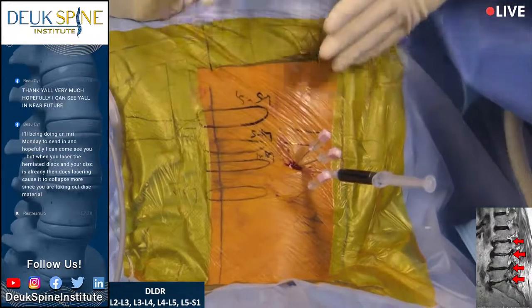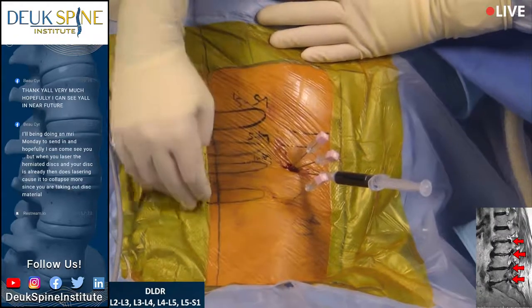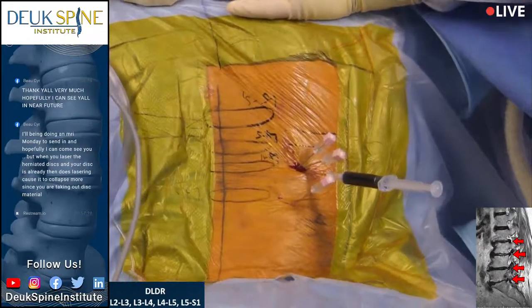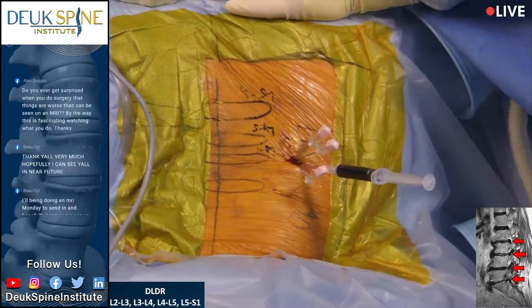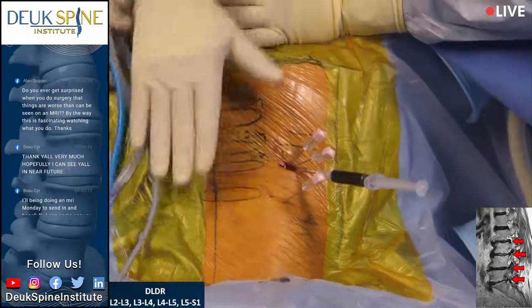remember, this patient came to me with an MRI showing herniated degenerated disc with annular tears at L2-3, L3-4, L4-5, L5-S1. You can see the MRI. And he's got a lot of back pain. Lay still. And when I asked him, where is your back pain, he said, it's right in here.